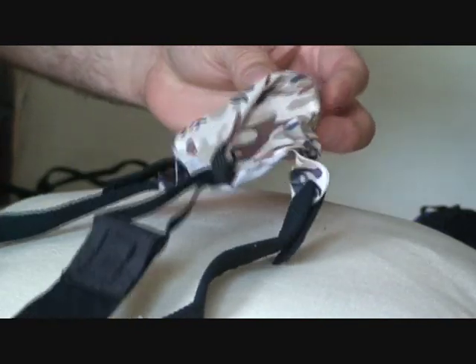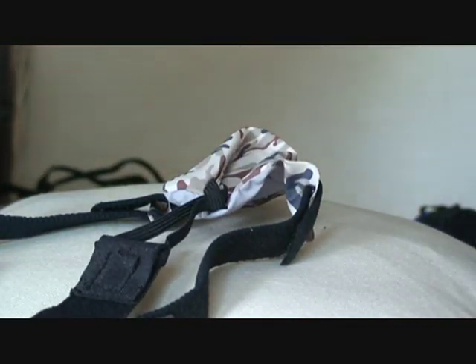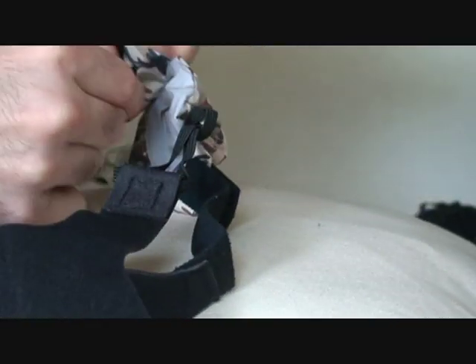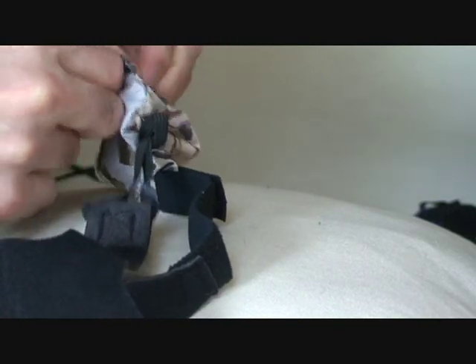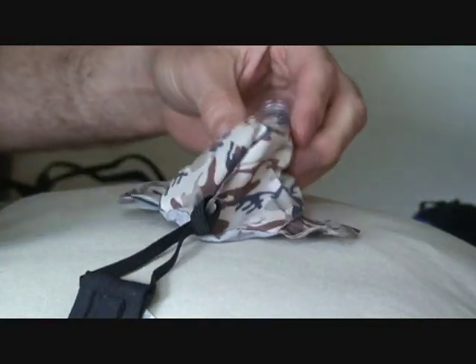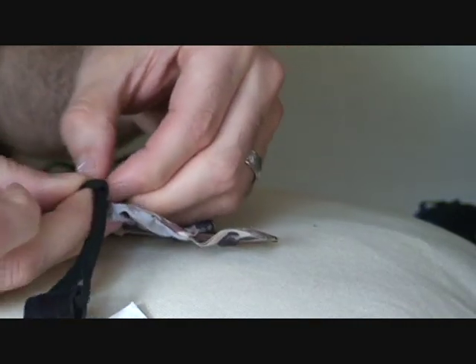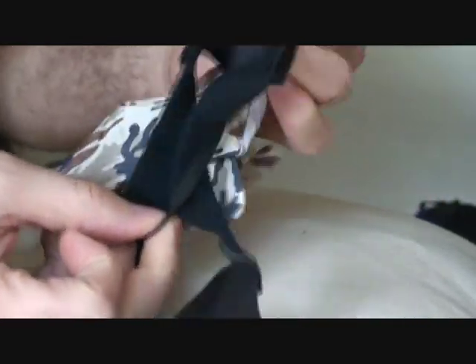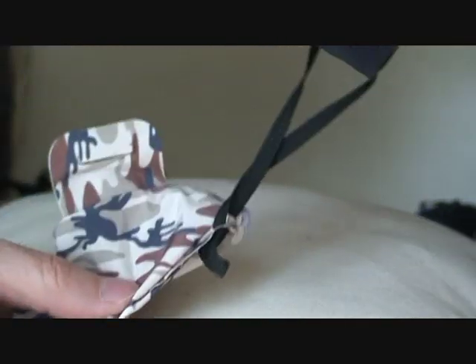That's good. So this is how you change the headgear on the Circadiance SleepWeaver Advance. First thing you want to do, take off the sides here. Okay, now for the centerpiece. So I'm going to try to pull as much of this slack through as you can, creating a big hole, and then you pull basically all the headgear through that hole, which allows you to pull this through the eyelet. So, pretty easy, yeah?